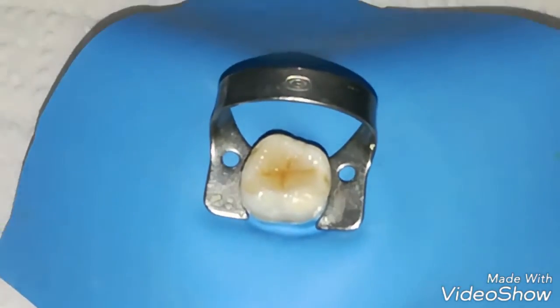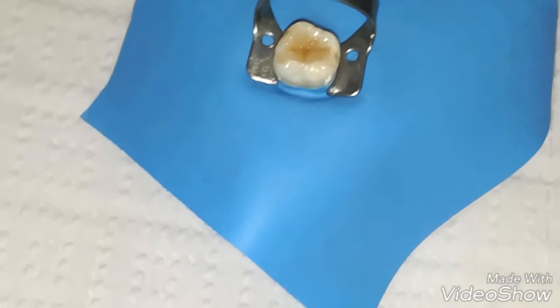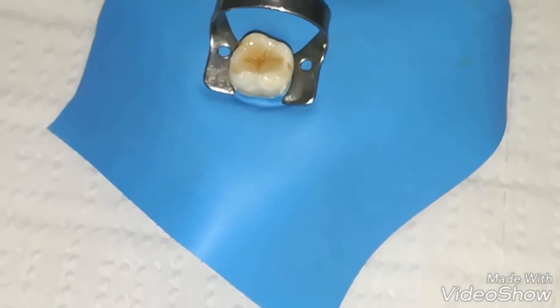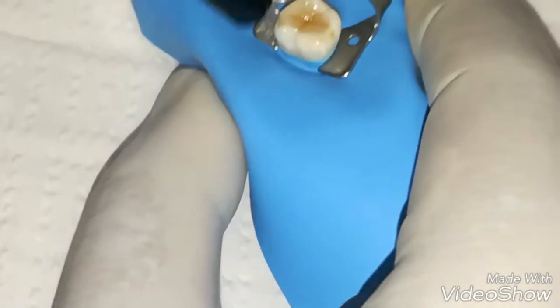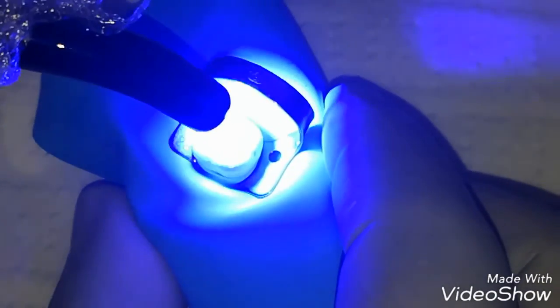Now we are going to light cure it for another 20 seconds or more.